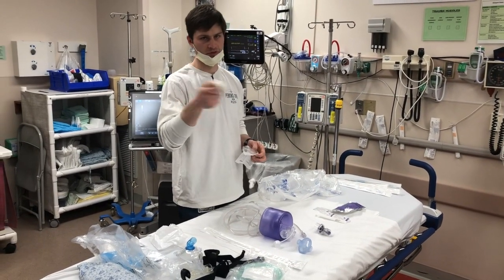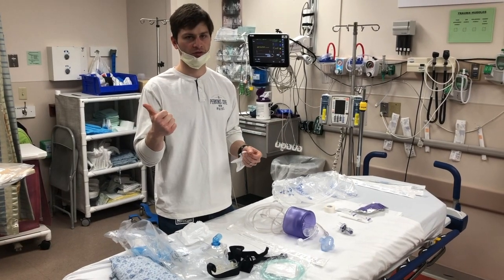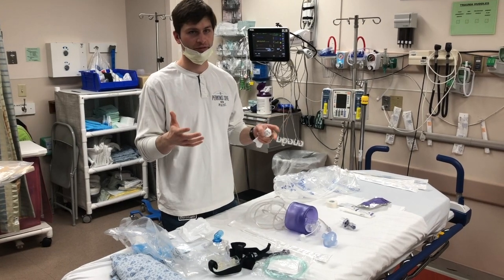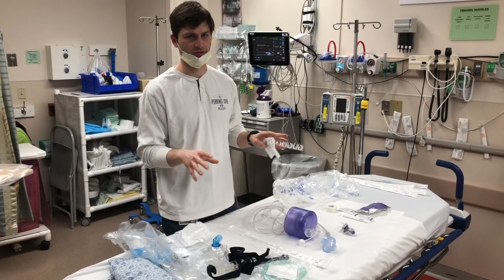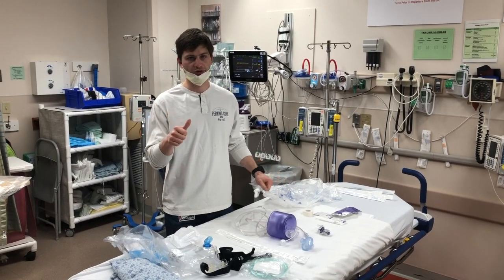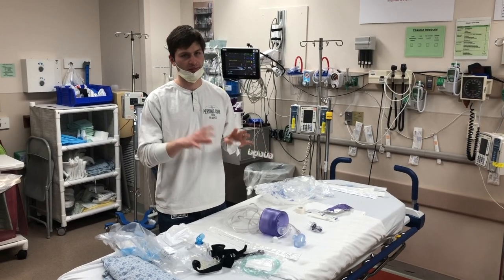And then some tape for when we secure the tube when the patient's intubated. Understand that there are a couple of other things you need when you intubate somebody — endotracheal tubes obviously, but that's going to vary based on the size of the patient, so you'll have to grab that separately. OG tubes and all that stuff — we're just trying to keep these kits for pretty much immediately what you need for the potentially crashing patient. Other adjuncts like bougies and oral airways: you're not going to need that on every patient.